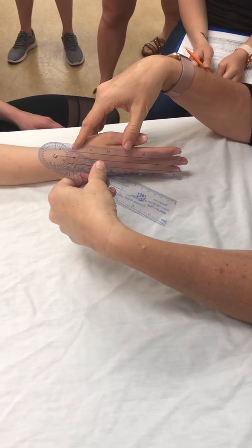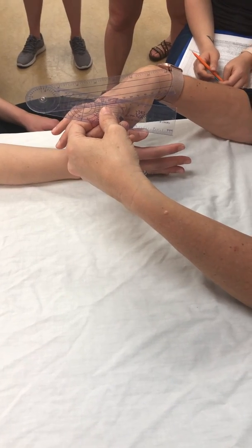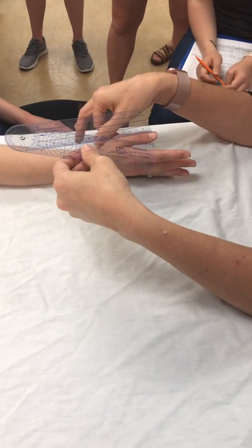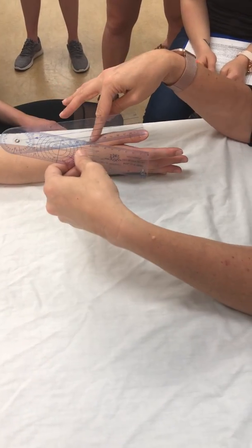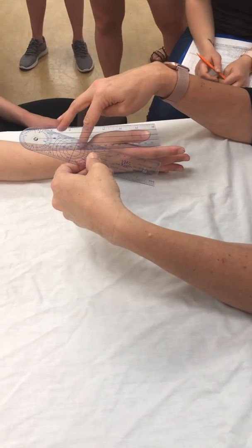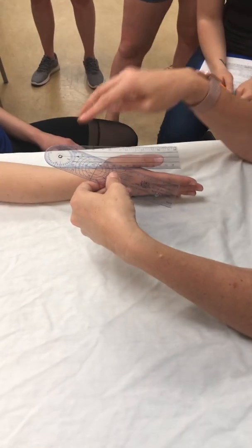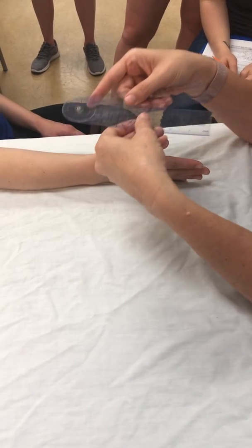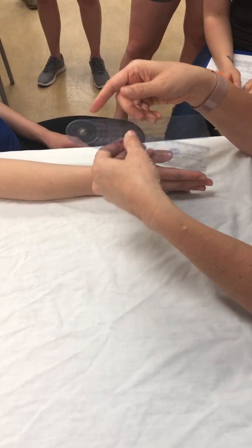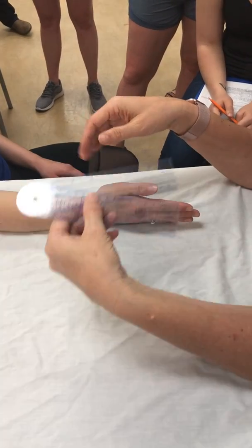The stationary arm is going to be along the second metacarpal, and the moving arm is going to be along the first metacarpal. The axis is going to be the radial styloid process. That's a starting point. You want to bisect the segments, and so you will move the goni so that you can get that bisection of the segments, regardless of whether or not this is actually on the radial styloid process.